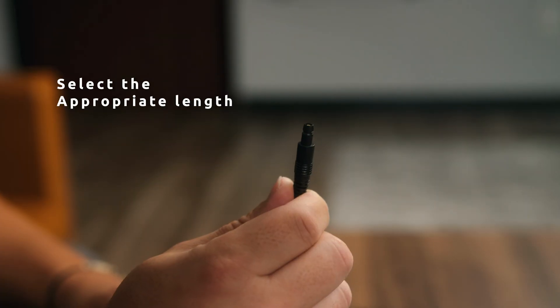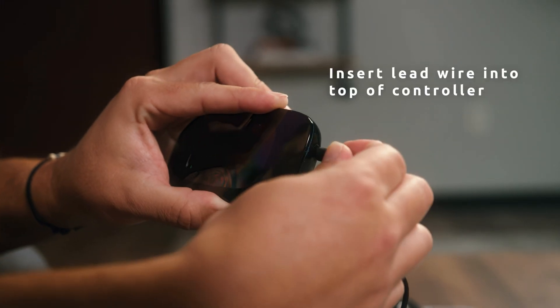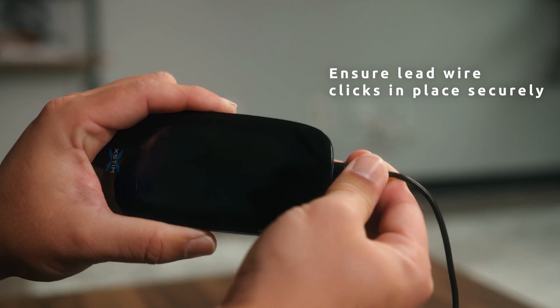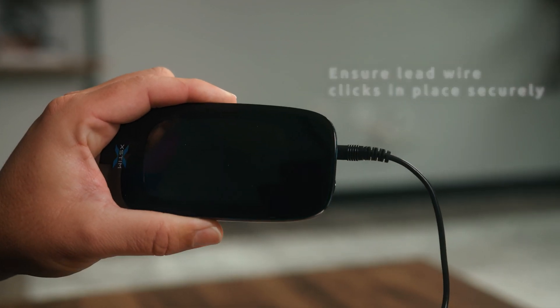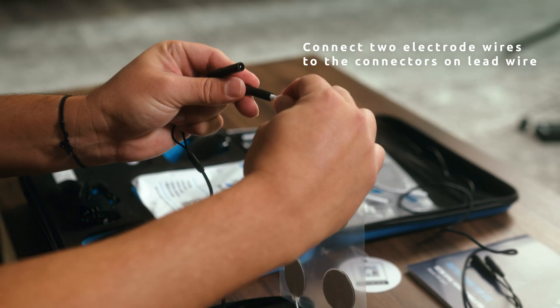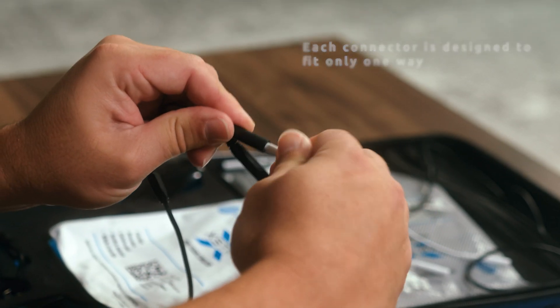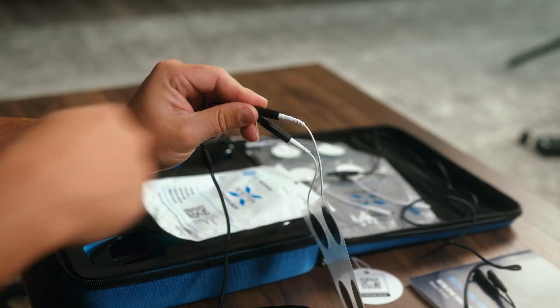First, select the appropriate length of the lead wire. Insert the lead wire into the top of the controller and ensure it clicks into place securely. Next, connect the two electrode wires to the two connectors on the lead wire. Each connector is designed to fit only one way, ensuring a secure and correct connection.